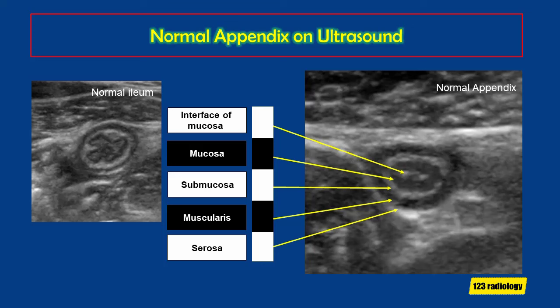The normal sonographic appearance of the appendix is that it has inner hypoechoic mucosa without folding. Its diameter is less than 6 mm and it is compressible. Sometimes it contains air, sometimes stool, and there is normal mesenteric fat surrounding it.